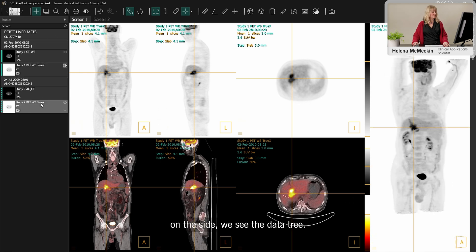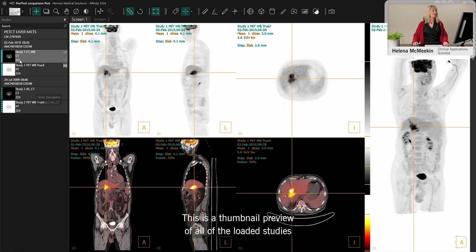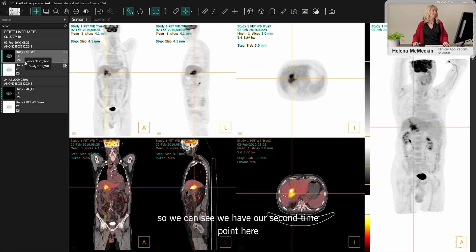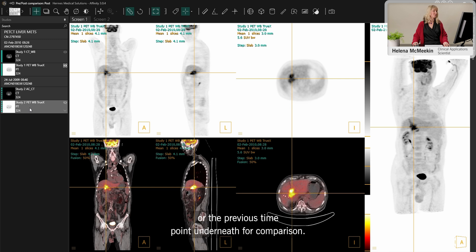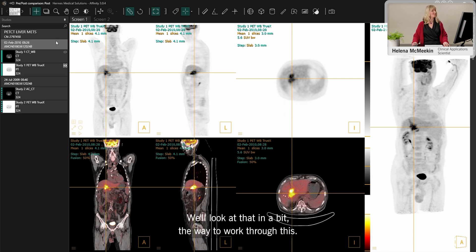On this side we see the data tree — this is a thumbnail preview of all of the loaded studies. We can see we have our second time point, the previous time point, underneath for comparison; we'll look at that in a bit.